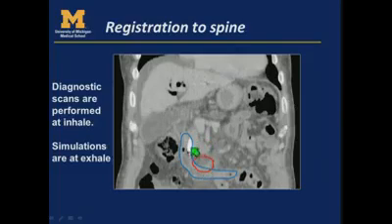And so instead of radiating the pancreas tumor up here, you're now radiating the duodenum instead and not treating the pancreas tumor. And this is very easy to do because the alignment is not necessarily intuitive, and you can't really see the pancreas tumor without contrast as a kind of logical double check that you're doing something right. So it's very important not to do this.